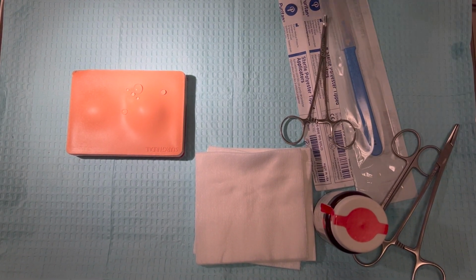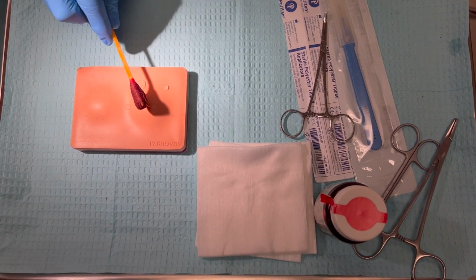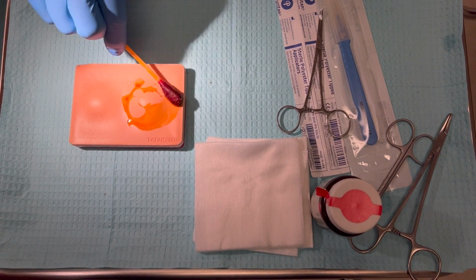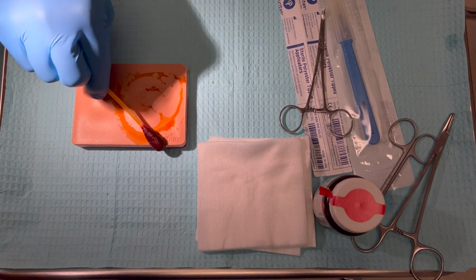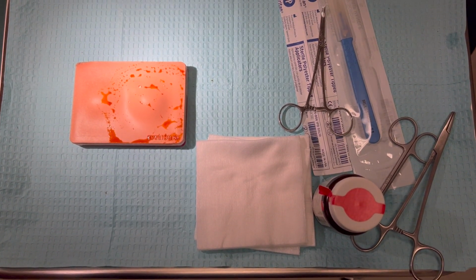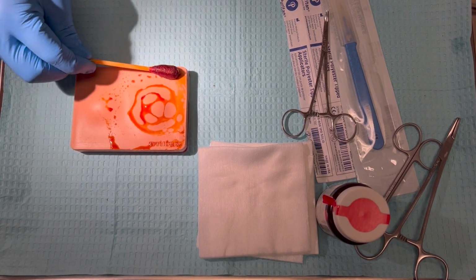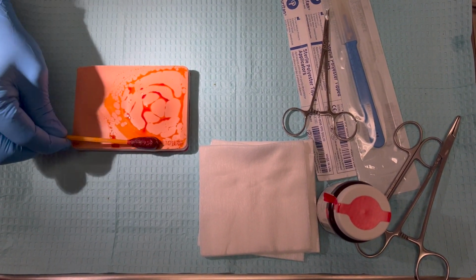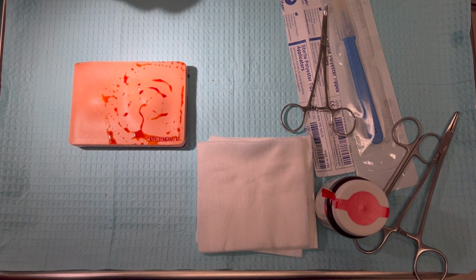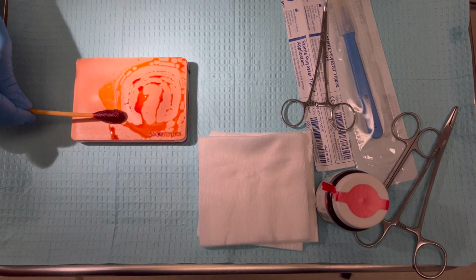To start with, first we'll open our betadine swabs. I'll apply this in a circular motion, starting at the area where I'm going to start my incision and work my way out into that surrounding area. And I will repeat that times 3. While this is not necessarily a sterile technique, it is still a measure we take in order to reduce any potential further complication of infection from this procedure.